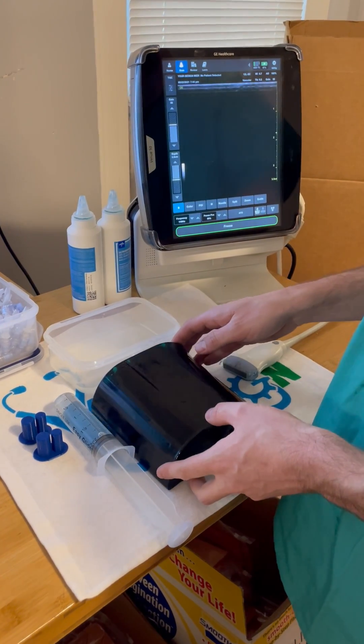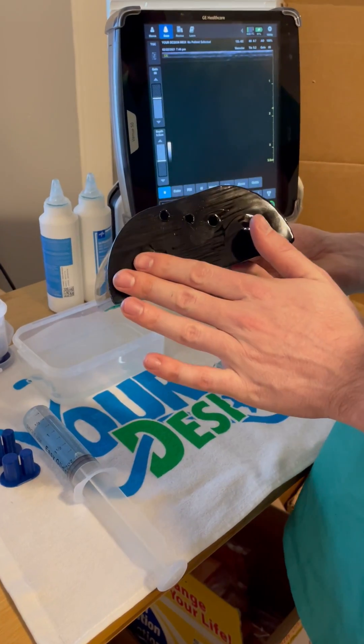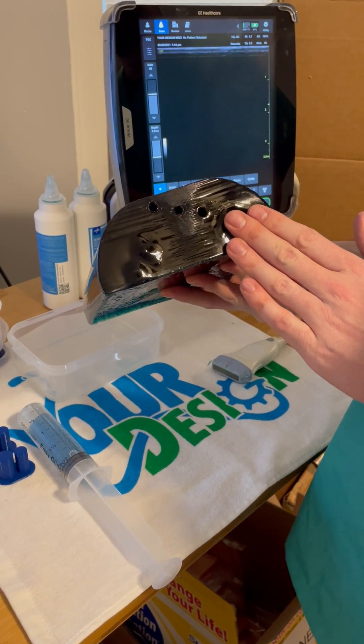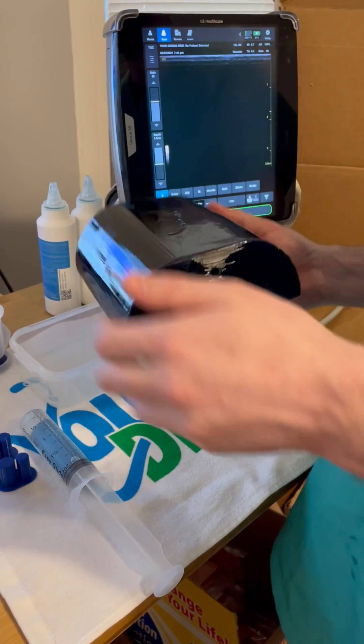Hi there! I'm going to show you guys the new 2021 version of the Central Line Trainer. On one side, the major vessels are sealed and terminate low in the model. There are three IV access ports that run through the middle of the Phantom.